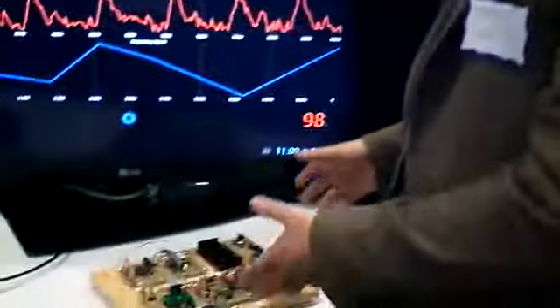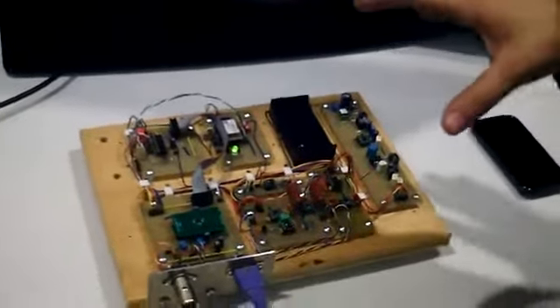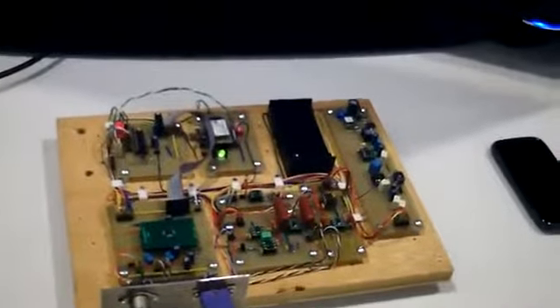And it's a lot of times inconvenient and very impractical to send home a full SpO2 machine or a full ECG machine and that sort of stuff to record it. So what we've done is develop a very low cost, very, very portable platform. It's actually a lot larger than the production version is going to be. But we're able to actually capture SpO2 and ECG right now.